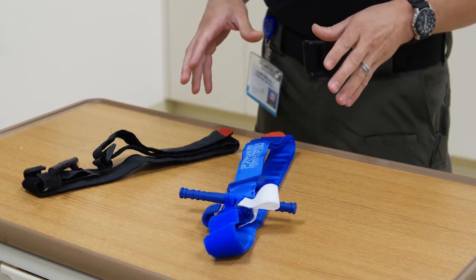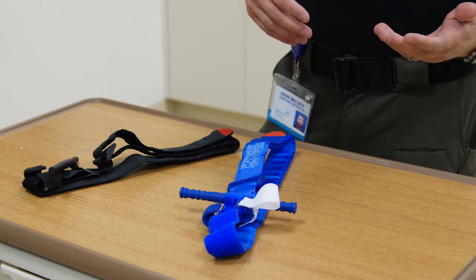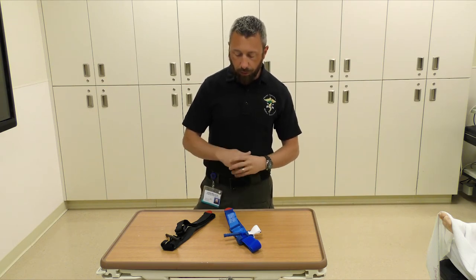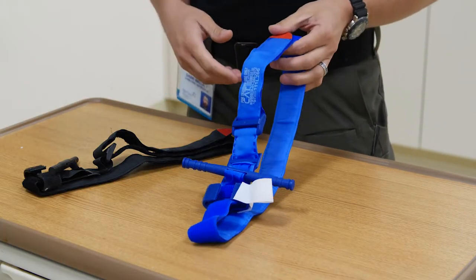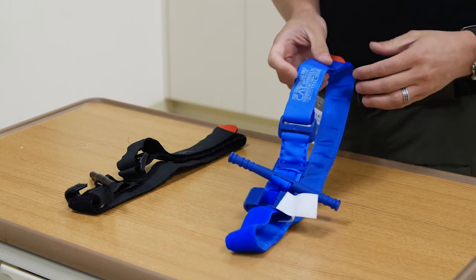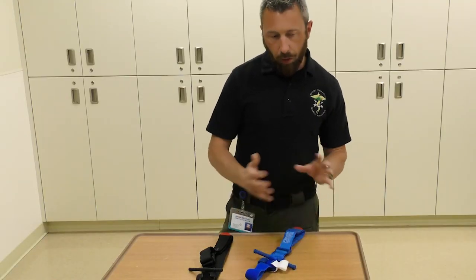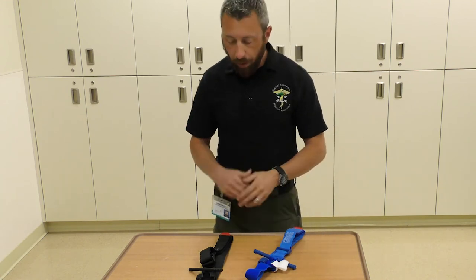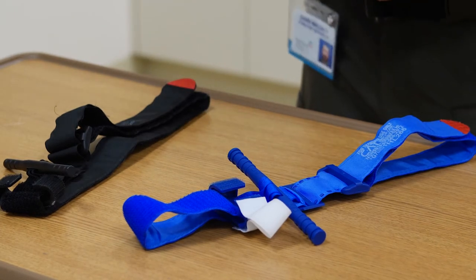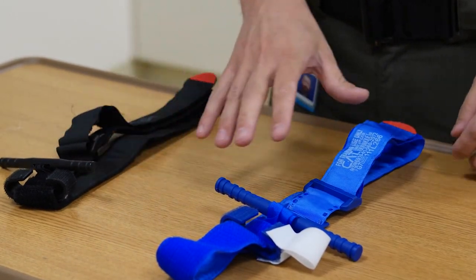Now let's talk about tourniquets. These are the typical tourniquets we advocate in the field. I'm a full-time police officer and combat medic, also served in the armed forces and was deployed, so I've used these extensively. This is the CAT tourniquet — Combat Application Tourniquet — made by North America Rescue Products. I have two variations. One important thing: if you see a blue tourniquet, that is a trainer, not meant to be used on a patient. The black and orange tourniquets are the two primary colors you'll see in your kits.